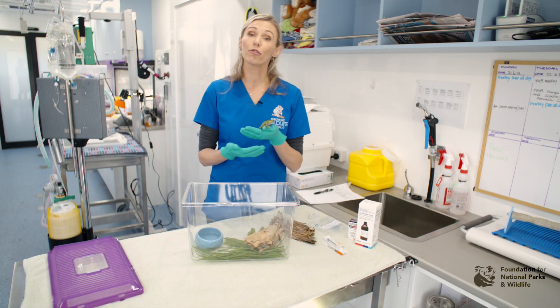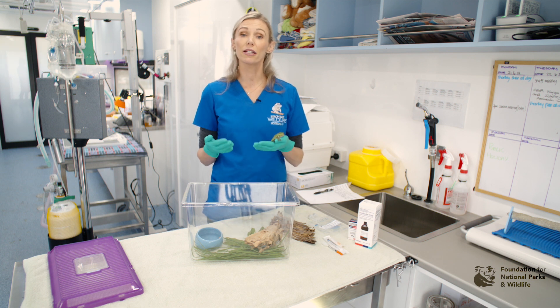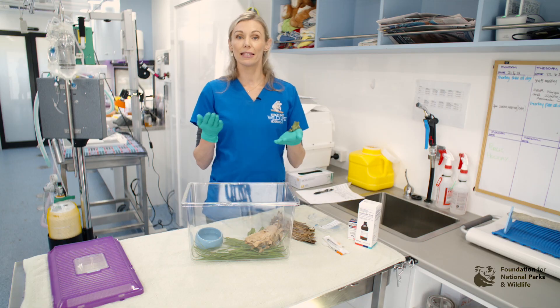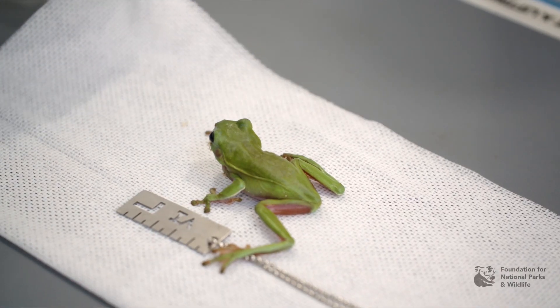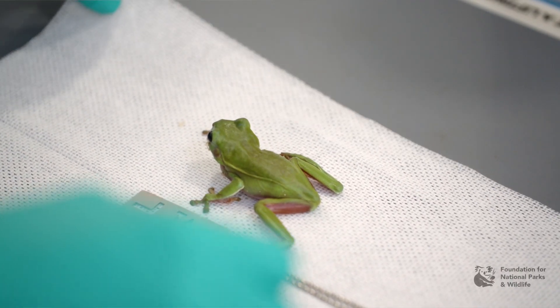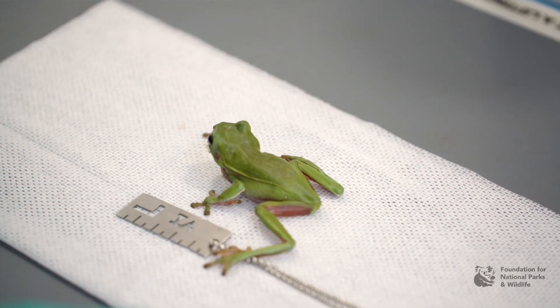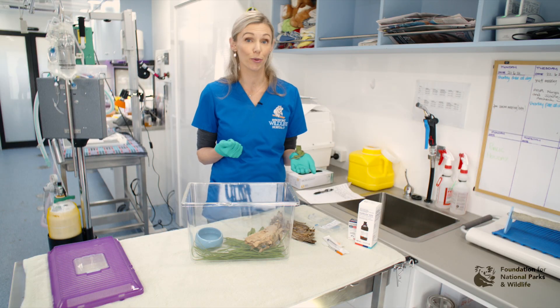To take an x-ray of your frog, the easiest way is to place the frog directly on your plate. I commonly use a damp towel that has been placed in a little bit of the frog's water to keep the area moist and clean. Alternatively, if the frog is a little bit jumpy, you can place it in a plastic bag with a small amount of water as well.